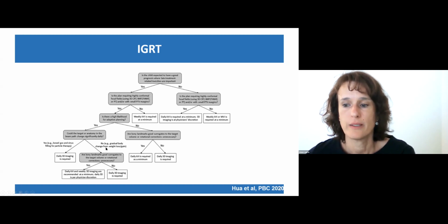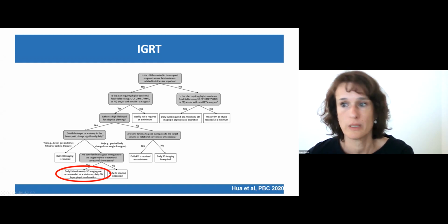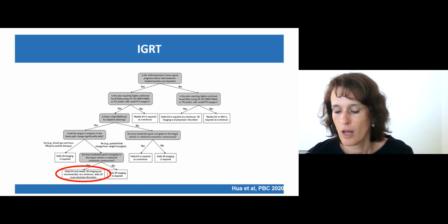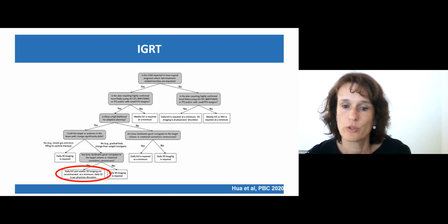So then it's up to the radiation oncologist to choose regarding his priorities, and also regarding if he has good IGRT to deliver IMRT properly. Anyway, I really like this paper which proposed a decision template. Here we are in these regions where there are good bony landmark surrogates with vertebrae. And I stick to this recommendation of the daily KV imaging and weekly 3D imaging to lower the delivered dose and still have a very good repositioning, and particularly very sharp on the dose gradients on the vertebra between the irradiated vertebra and the protected vertebra.